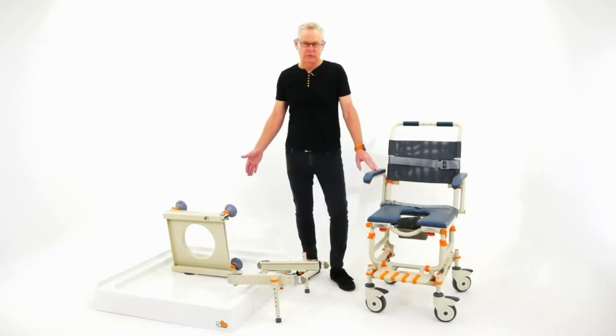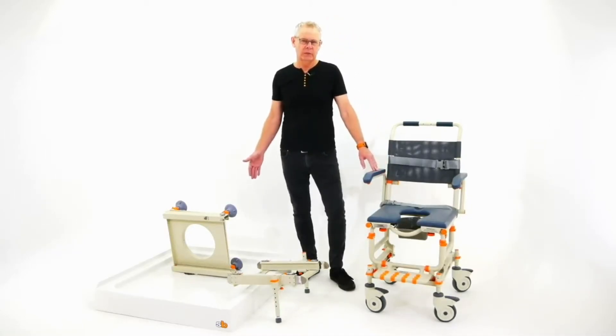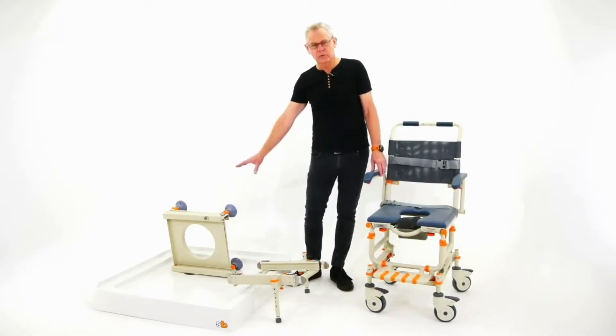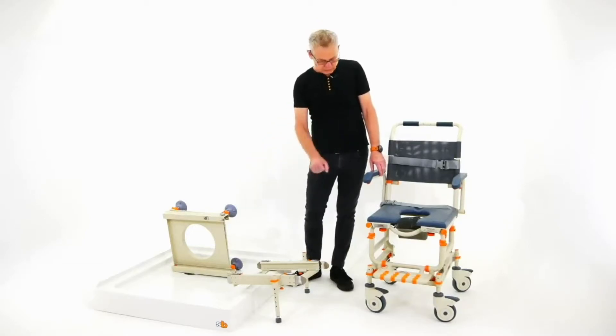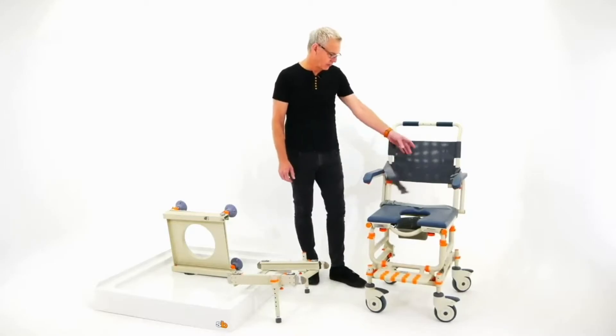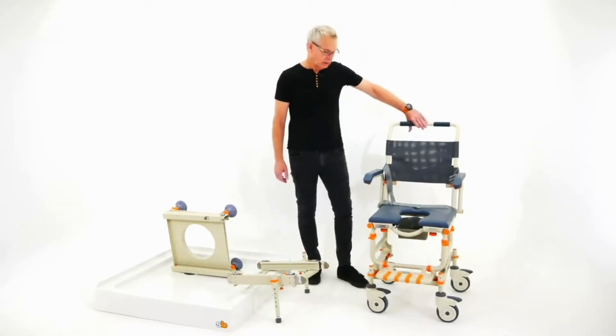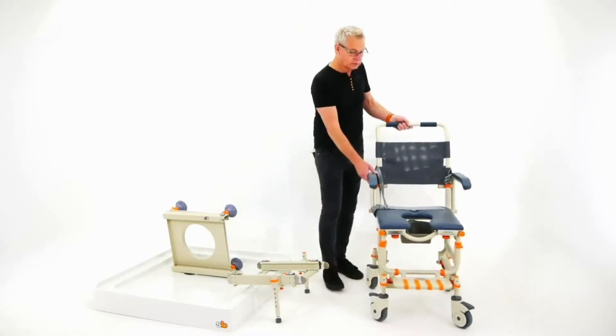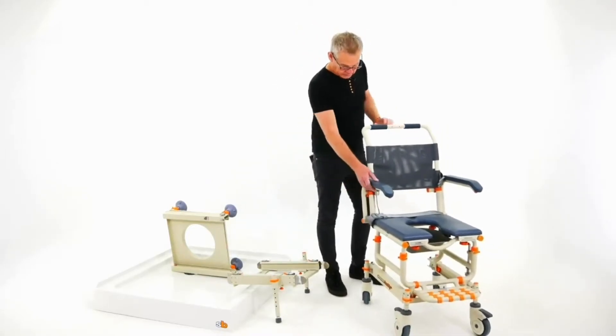We have three components that come complete with your package — there's no add-ons, it's all complete. There's a shower base unit, a bridge, and the rolling base or chair. The chair comes with safety belts and a commode bucket, which can be used over the toilet.